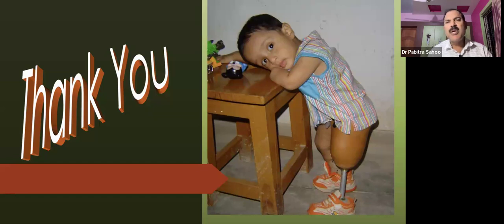If there is a very short stump, yes, the suspension system has a role. You have to give an external hip joint and a pelvic band around the girdle, so that it will stabilize the hip joint. But as far as the skin graft is concerned, you have to modify your socket and give clearance on that side, because femoral sockets are mostly total contact sockets, except a conventional socket like the quadrilateral socket. The commonest ischial containment sockets are almost all total contact sockets.